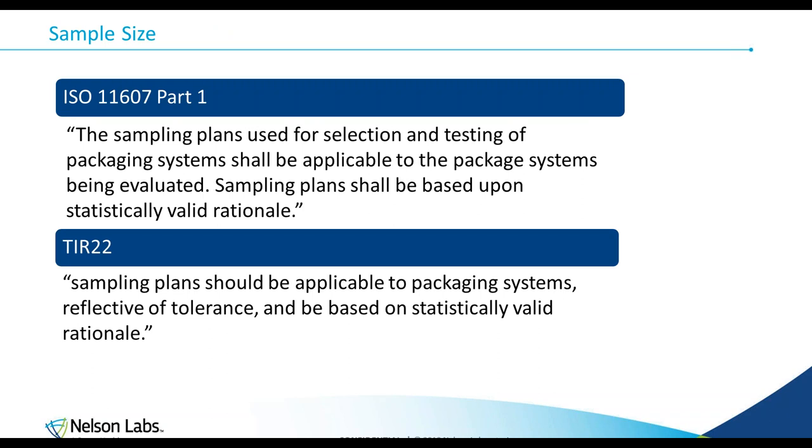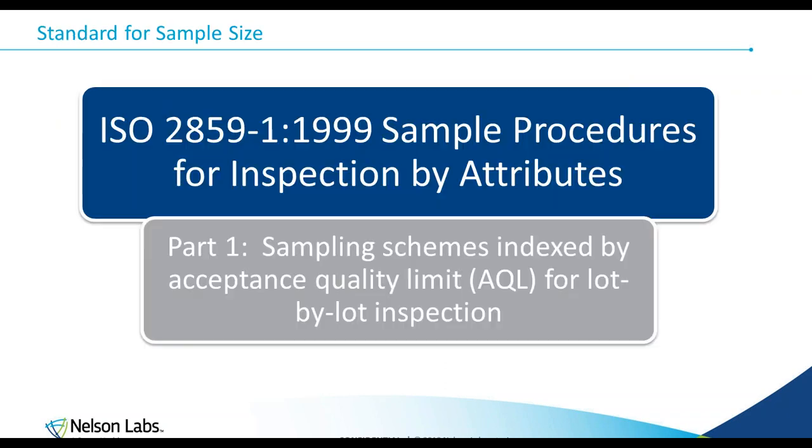As far as sample size, you're required to do a sample size rationalization for any kind of testing for medical devices. Unfortunately, the guidance documents aren't very specific on what sample sizes to use. They just require you to have the justification in-house, and they leave it up to you or your quality department to do the rationale. There is a guidance document, ISO 2859, which was produced in 1999, and this is really an AQL process, and it results in really high numbers of samples, so we don't typically recommend it.